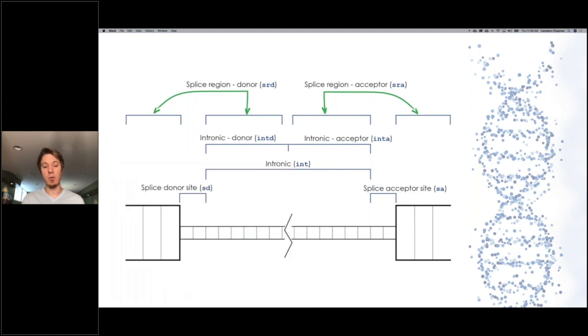One of the ways that we do that is by making sure that we show you all of the relevant variants and then prioritizing the most relevant at the top of the results, so that you don't miss anything, but also so that you don't spend time unnecessarily wading through evidence that might be less relevant for your particular case. We tend to think of prioritization in two separate pieces.